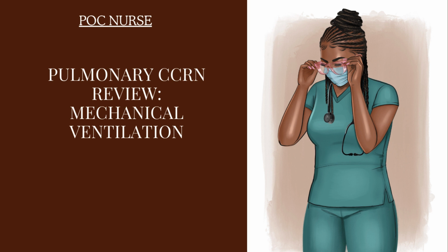If the patient, such as your asthma patient, is having bronchospasm, their airways are tight, the ventilator is going to go off because it will require more pressure to deliver oxygen into the patient. If the patient has any kind of edema in their airway, the airways become smaller. The ventilator alarm is going to go off, signaling that there's high pressure in the system.